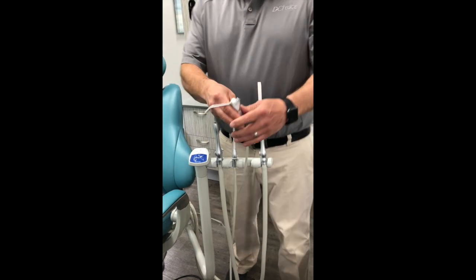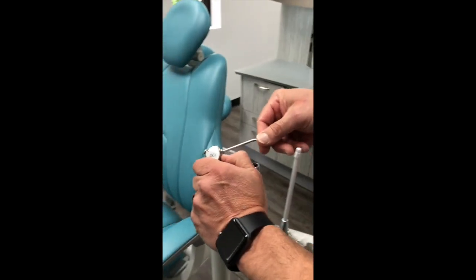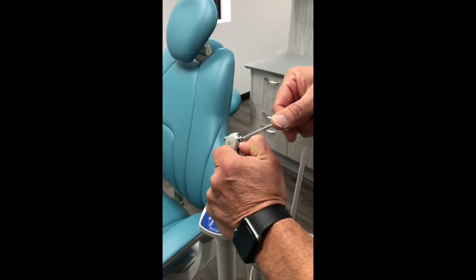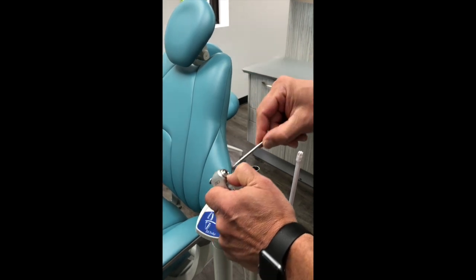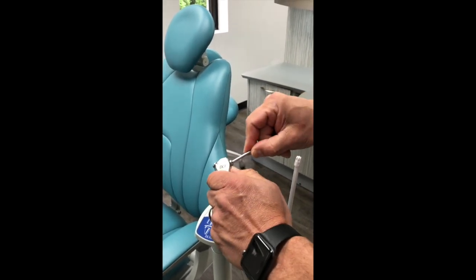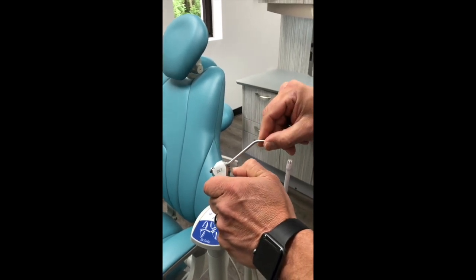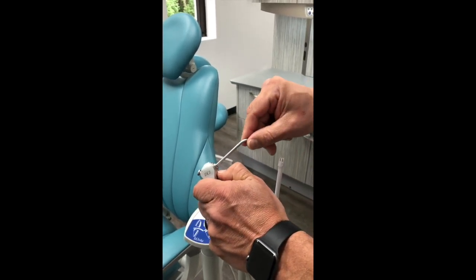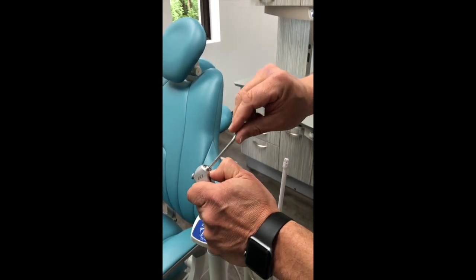The syringe is very easy to use. To change the syringe tip, you simply indent the ring and pull out. These are autoclavable so they can be sterilized in between patient use. They are also indexable — if you press it down you can rotate it in increments so that you can actually use that as a cheek retractor as well.